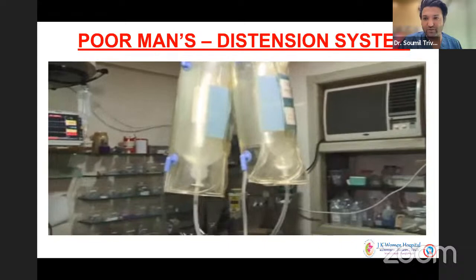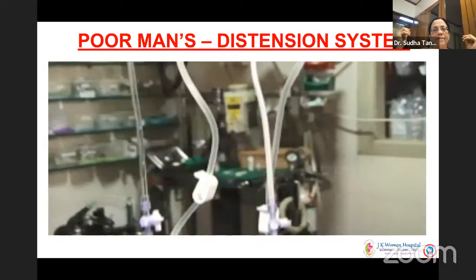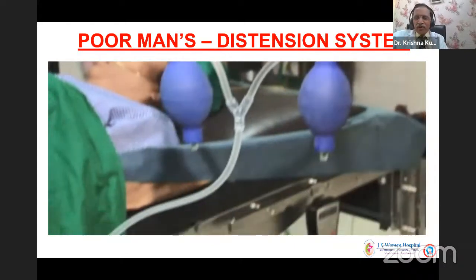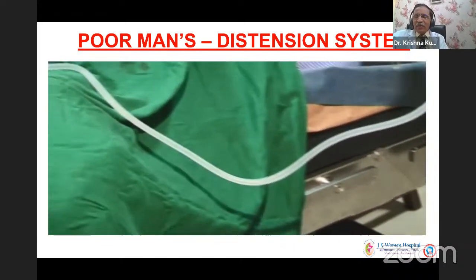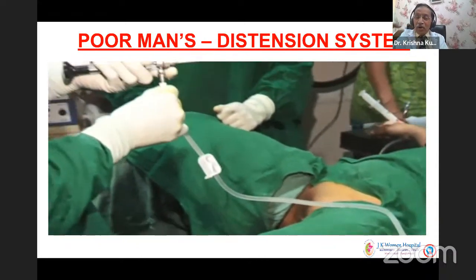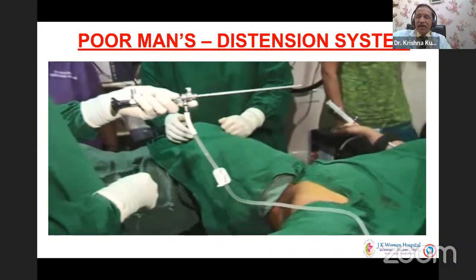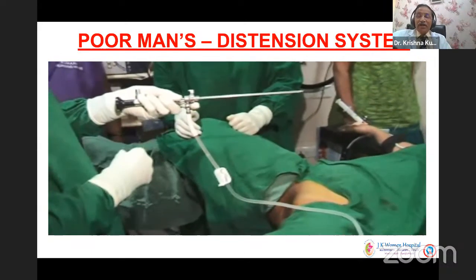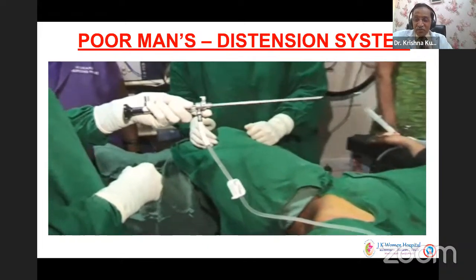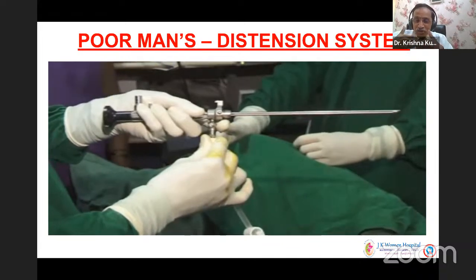Very true. So the two pressure bags, the Medex bag with the TUR set, seem to be working wonderfully. And as rightly said by Anurag, consider the time taken in hysteroscopic surgery and the amount of fluid you lose in 1 minute. If you're pumping 3-liter saline, within how many minutes is it getting empty? That is important. If it is getting empty in 5 or 7 minutes, a 3-liter bag means your fluid pushing is too much. So that's what I follow now, because I've never found a right distending device till now.